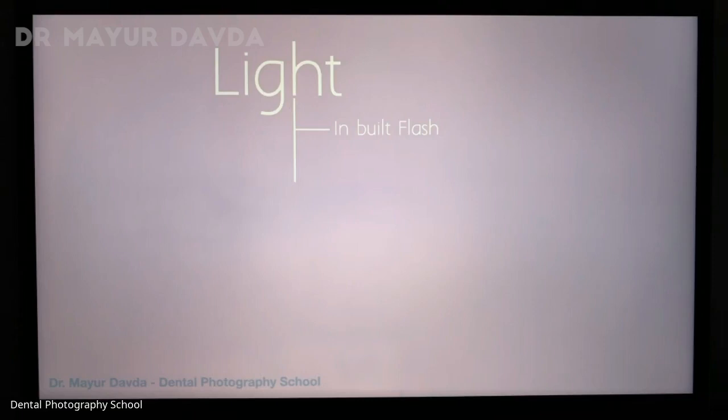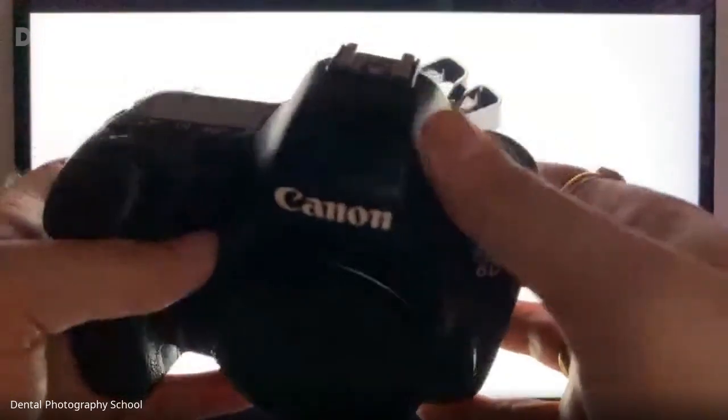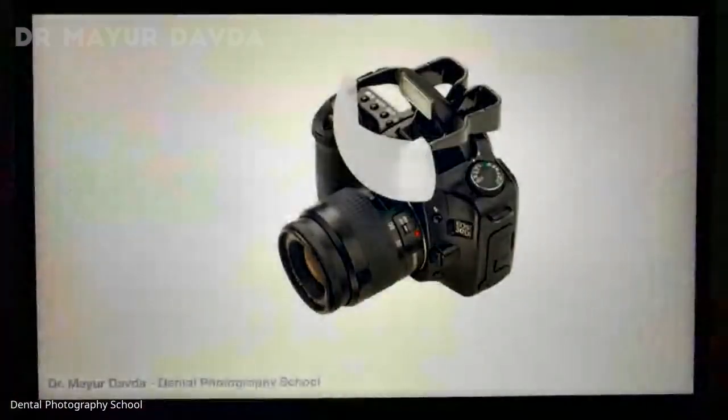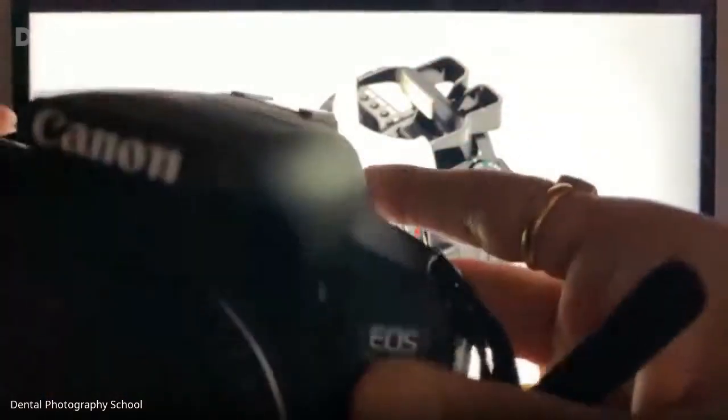So we have four different types of flash that we use routinely. That's inbuilt flash, twin flash, ring flash, and studio light. Inbuilt flash is there in almost all the cameras. What I did not tell you is the professional cameras, meaning the high-end cameras, do not have inbuilt flash. So you can see I have a camera over here. It's a full frame camera. It does not have an inbuilt flash. But entry level cameras like a crop sensor camera do have an inbuilt flash.